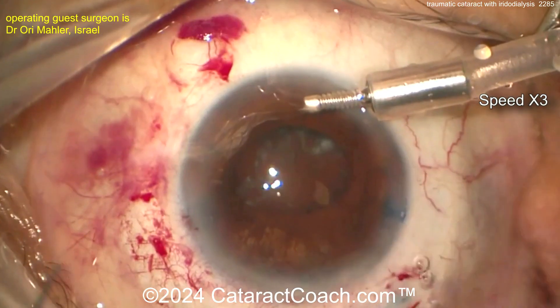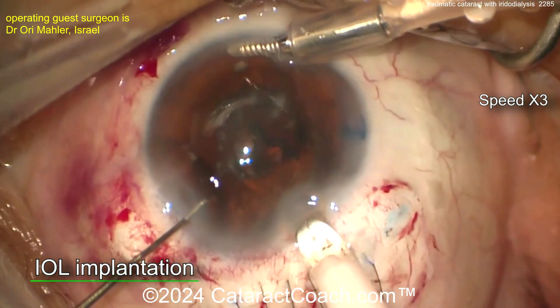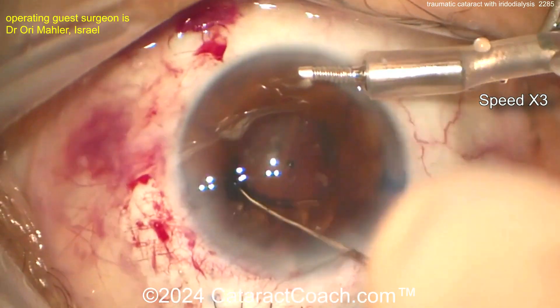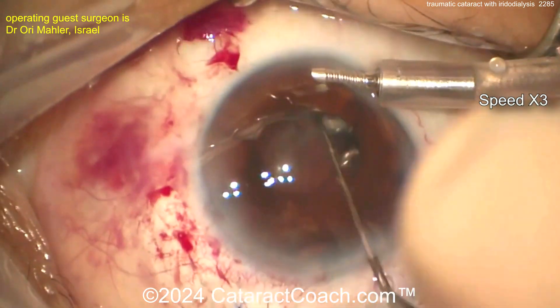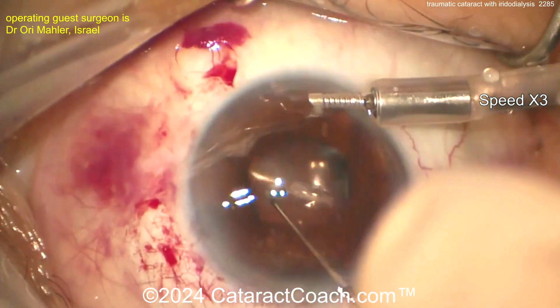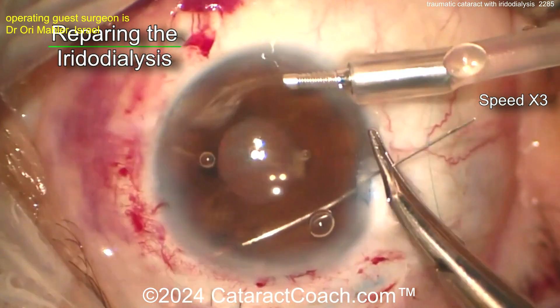Sewing up that main incision — good closure, that's a watertight closure for sure. Now putting the IOL in through that small incision. Getting that IOL into the capsular bag — hopefully there's enough support. Getting it centered up.